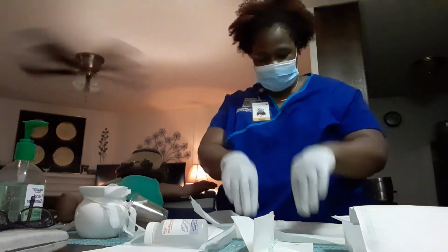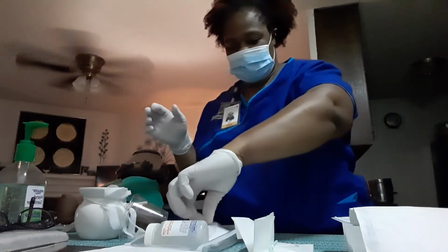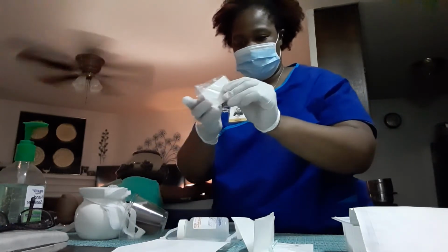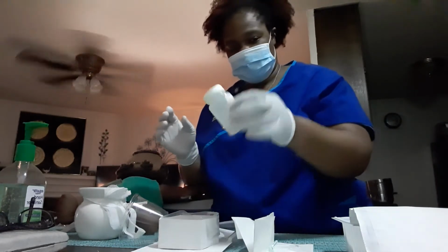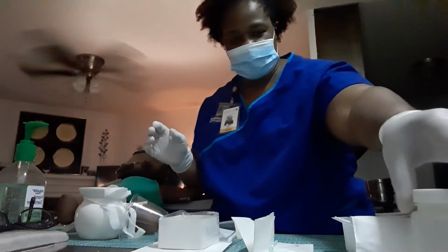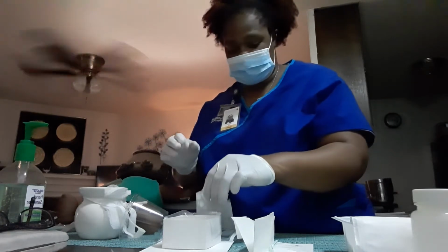And I'm just going to touch the inside of the packaging and throw that away. I am going to open up my sterile water tray here. I'm going to pour in some sterile saline, and I'm going to set this to the side because I'm going to use that sterile water again, or sterile saline.